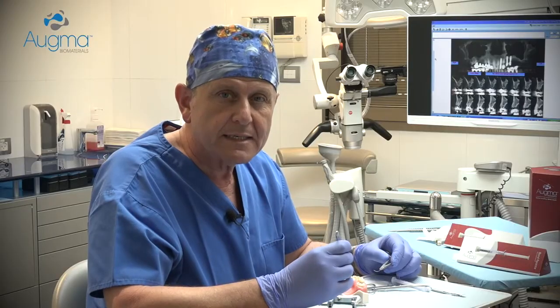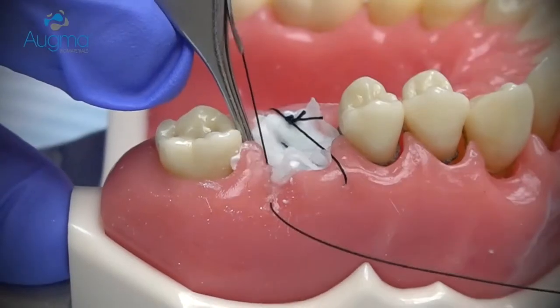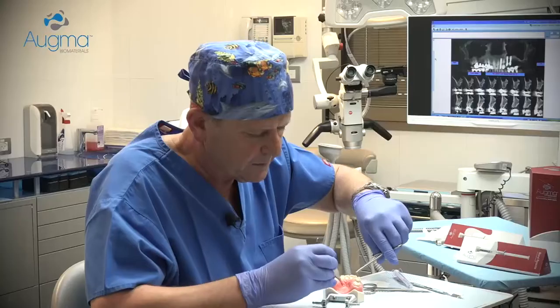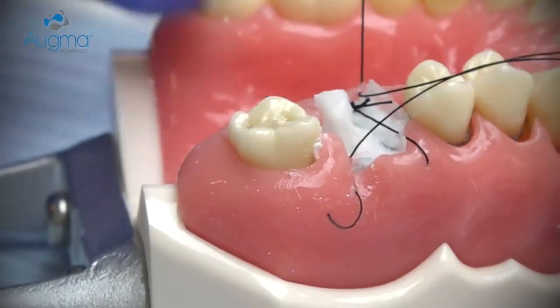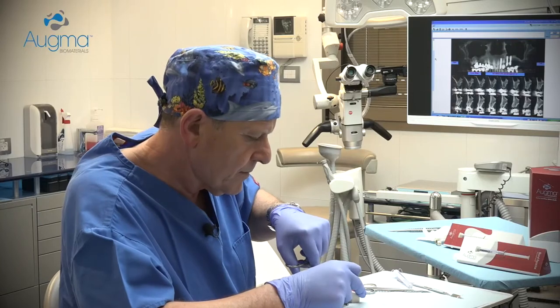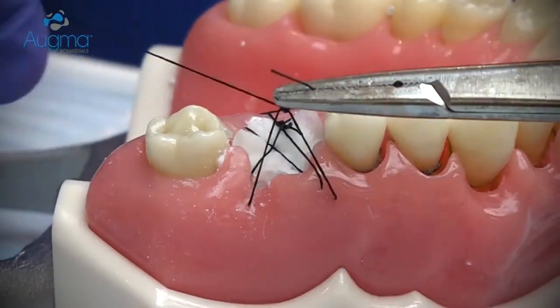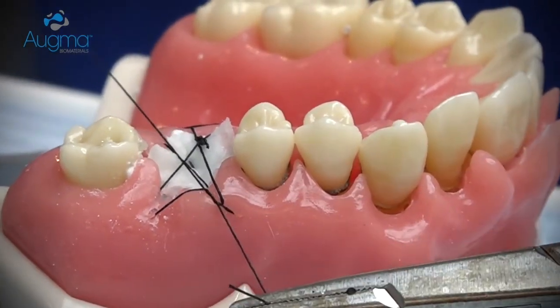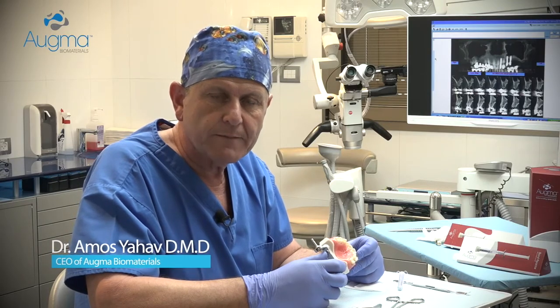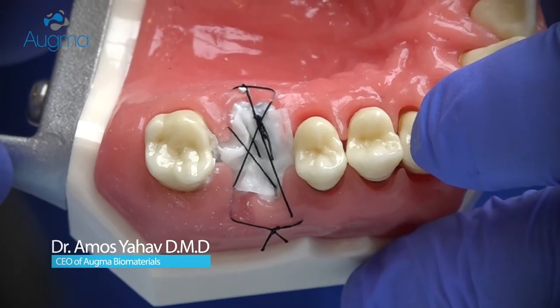After stabilizing the collagen sponge or membrane in place, you continue with a criss-cross suturing in order to protect it in a better way. Now the graft is protected and you can leave it exposed. Soft tissue will migrate above the graft and will close the area.